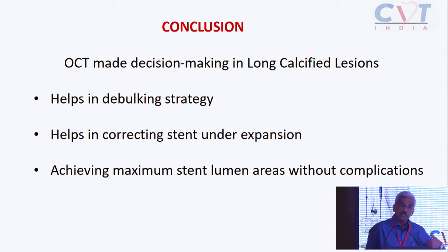It helps in what your lumens are, what your diameters are, and in your debulking strategy: what to do, what device to take. It helps in correcting stent underexpansion and achieving your stent lumen areas without complications. Thank you very much.